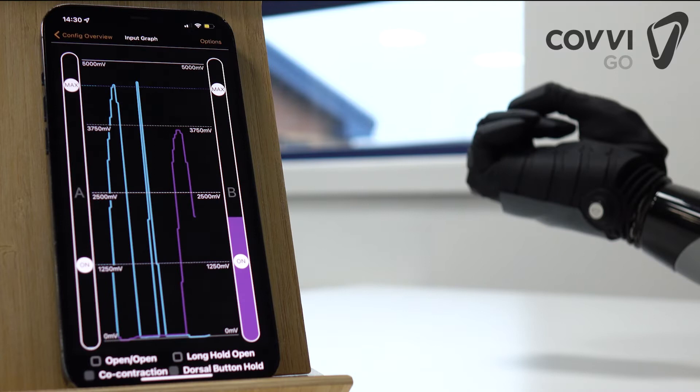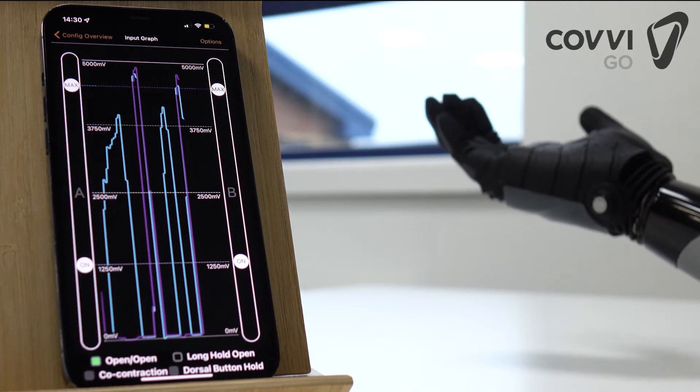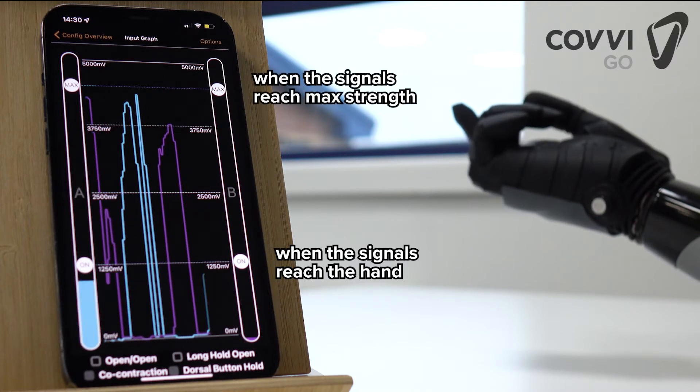The input graph allows users to set up the hand to respond to their unique signals. How the hand responds can be mapped to the user's own electrical impulses, with the on and max thresholds.